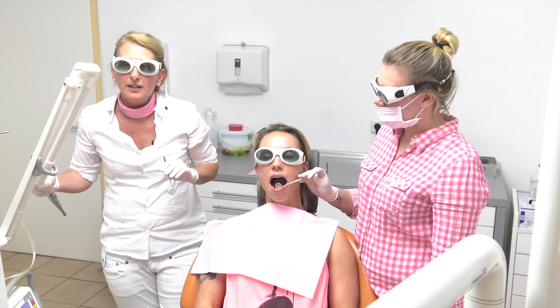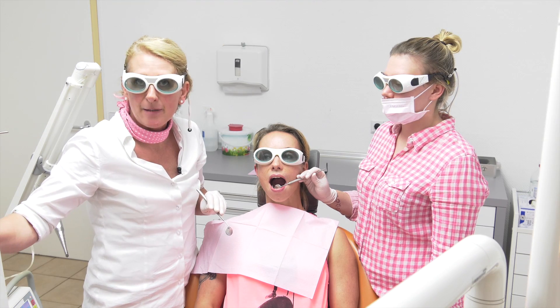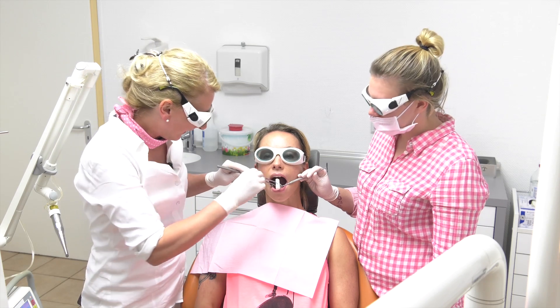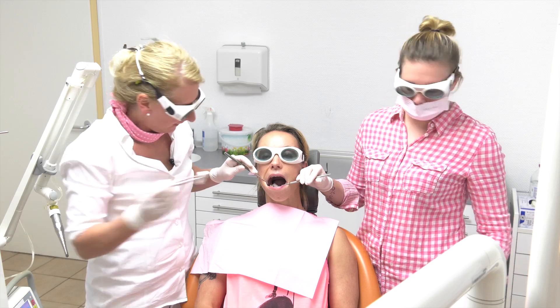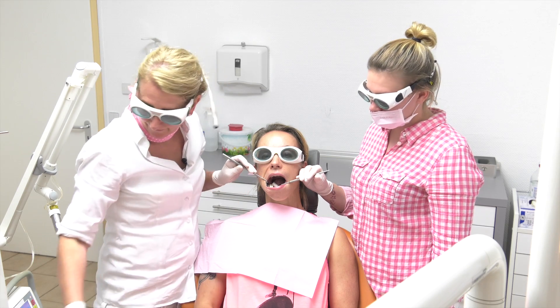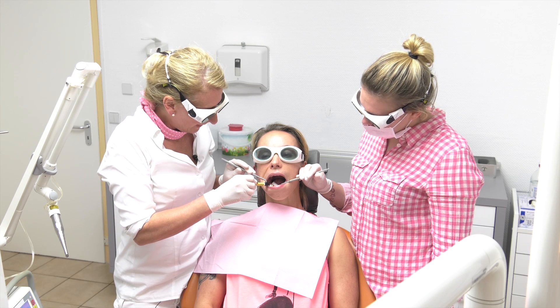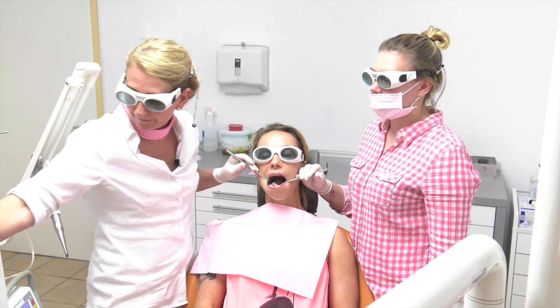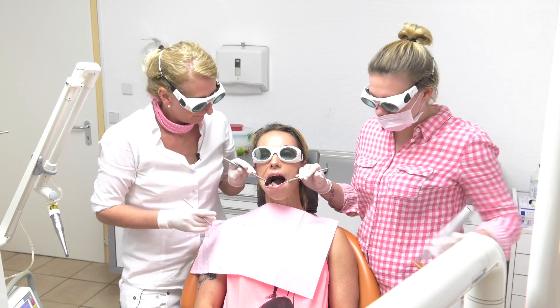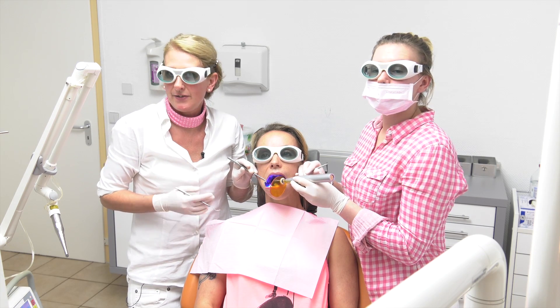Now when we put on the sealing, you should know that we only use cotton instead of drying it absolutely. And now we dry the teeth. Afterwards we put on our sealing, and the sealing must be very thin. Afterwards we take our light. And now the tooth sealing is already done.